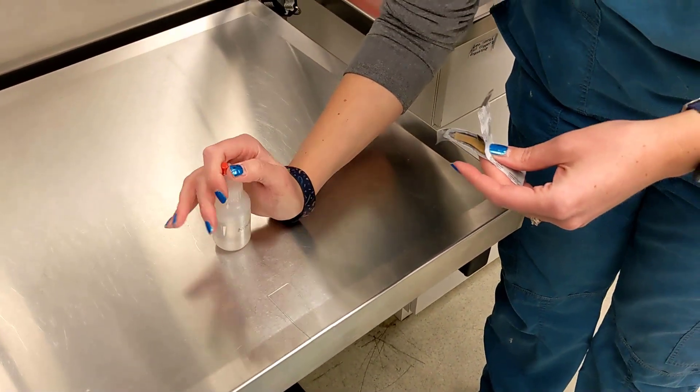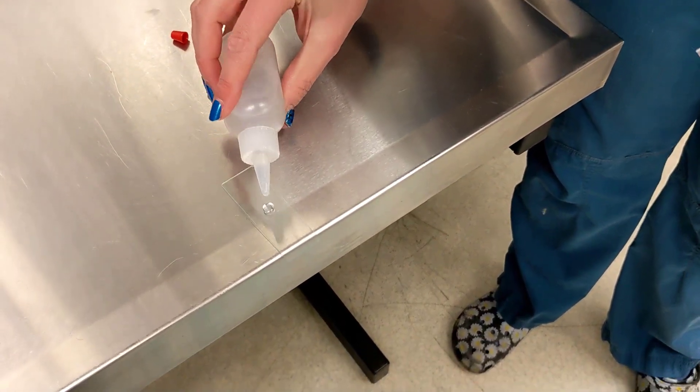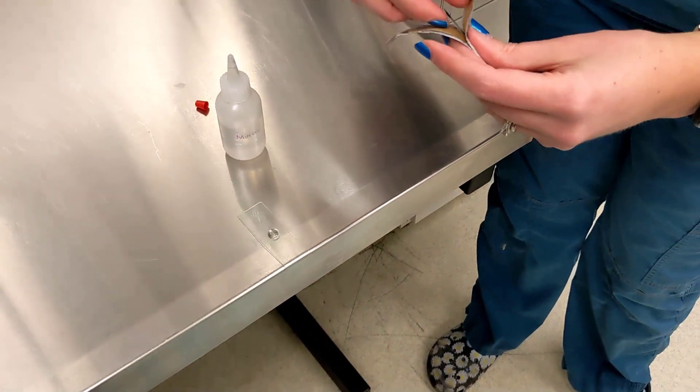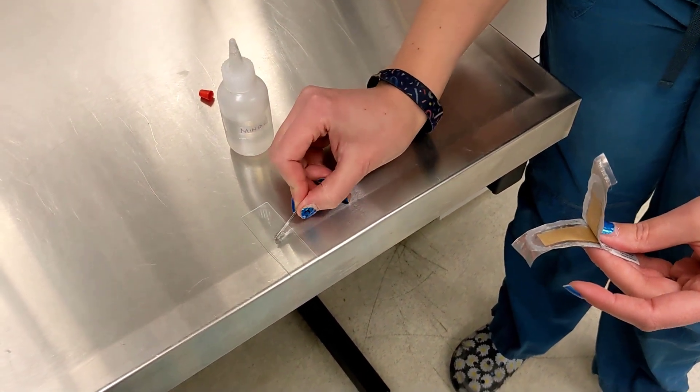We're going to take our mineral oil, we're going to add a couple drops to the slide — or one big drop as it may be — and we're going to go ahead and add a little bit to our blade too before we proceed.